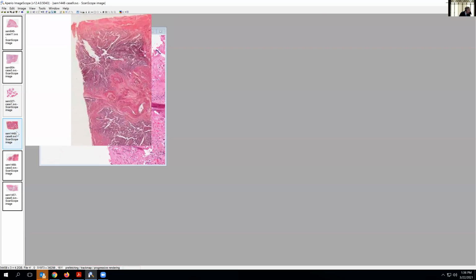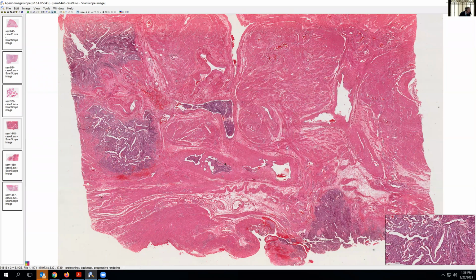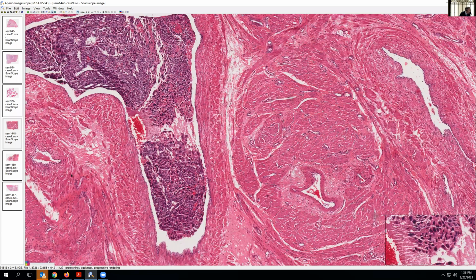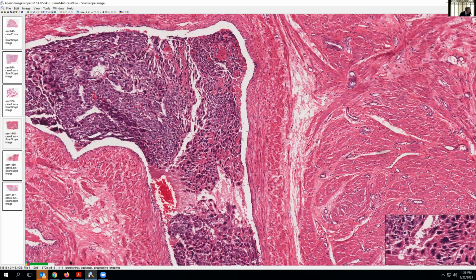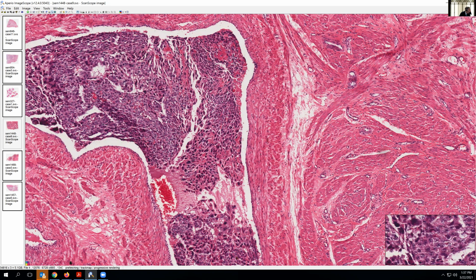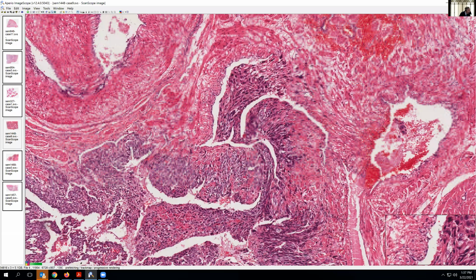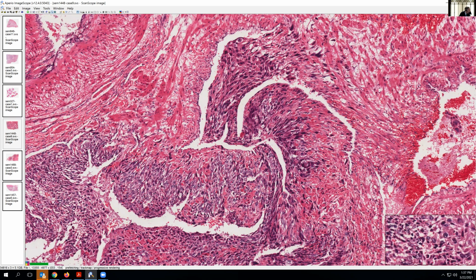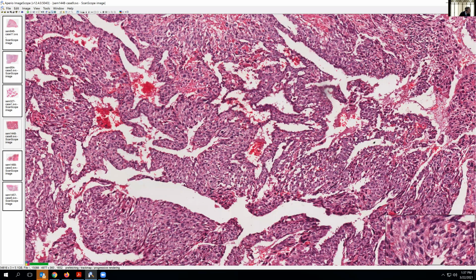Now, if we were to go to a resection sample, it might look a little bit more like this. We take a look and we can see here we have obvious vascular invasion by this neoplasm with multiple different cell types here again. Variable morphology, those more syncytial trophoblastic type cells, as well as the intermediate trophoblast in quite marked abundance, and here a little bit more as well. As we look at it in a more infiltrative pattern, we can see it involves the vessel wall and is forming this mass of tumor cells, a lot of cytotrophoblastic cells here as well.